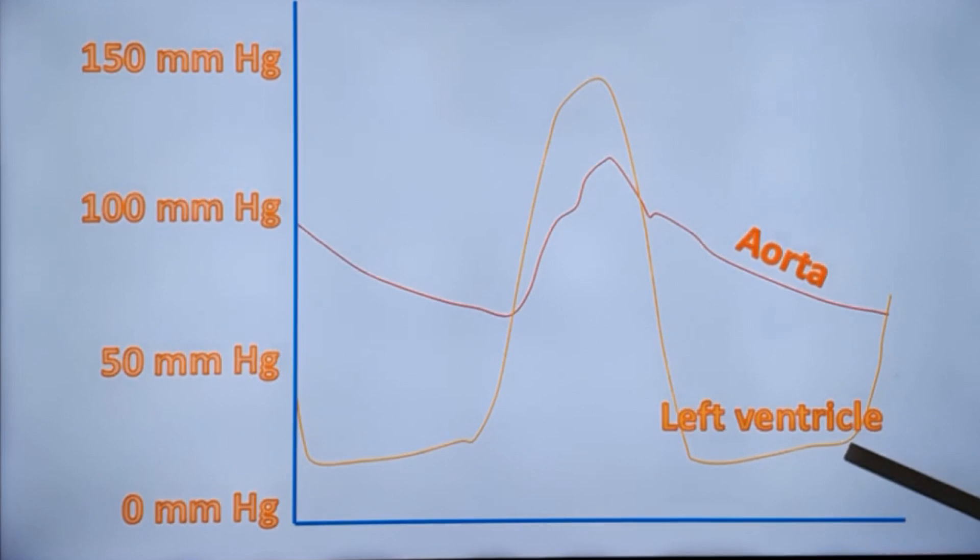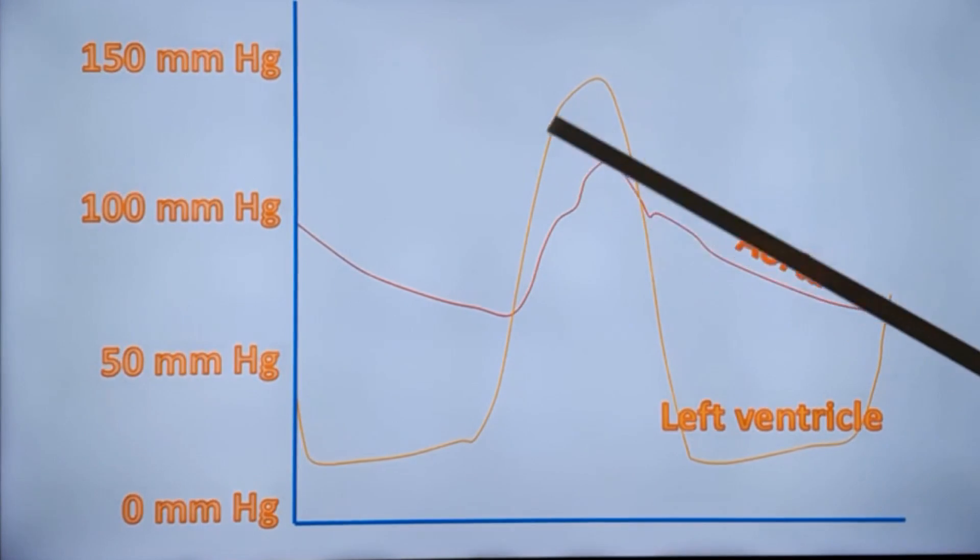This region will correspond to the left ventricular end-diastolic pressure. And this is the pressure crossover between the left ventricular and aortic pressure tracing.